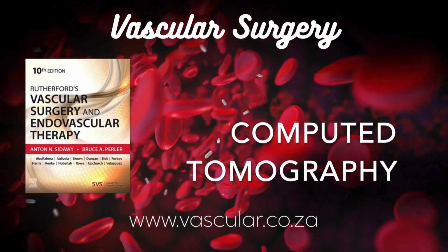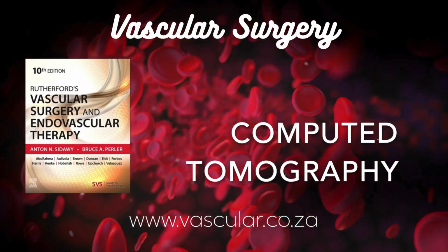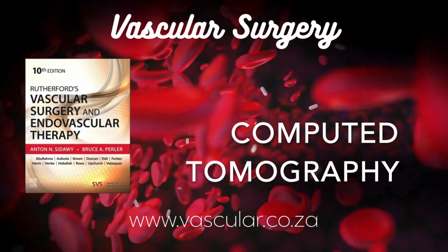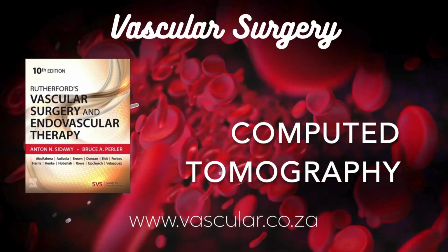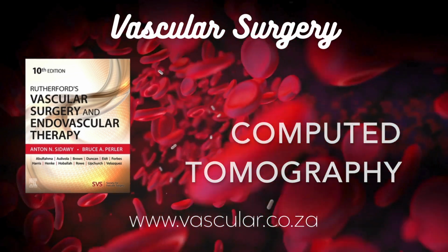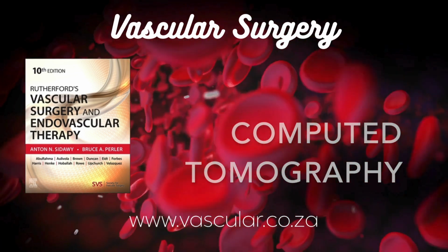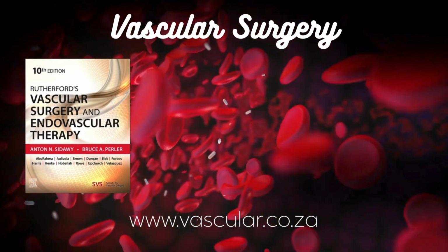When do those come into play? Dynamic CT is about looking at function over time, specifically tissue perfusion, how blood is flowing through the tissue. How's that done? You basically park the scanner over one location, inject contrast, and then take rapid sequential scans at that same spot over maybe 30, 60 seconds. Ah, so you see the contrast arrive in the arteries, then soak into the tissue capillaries, then wash out through the veins.